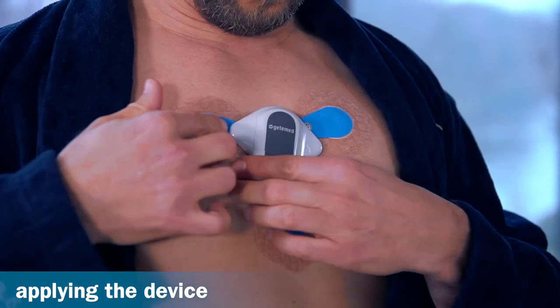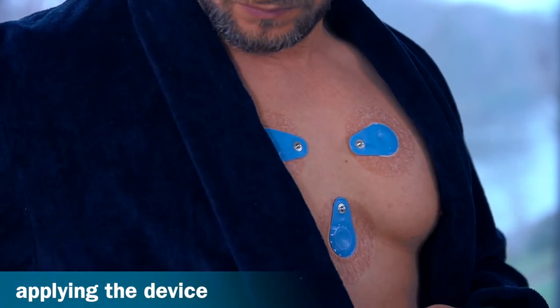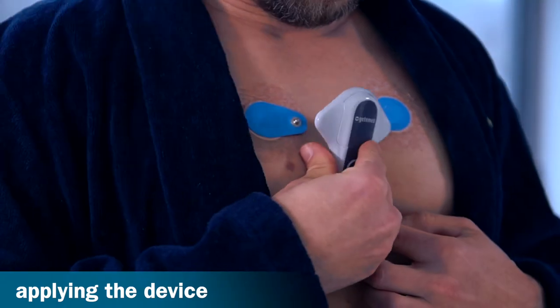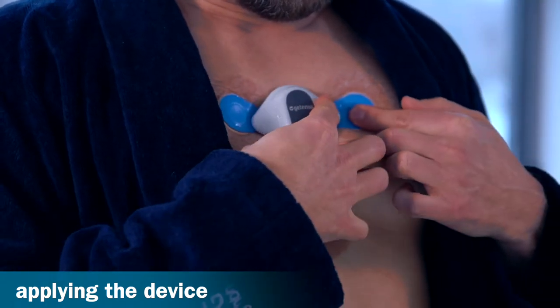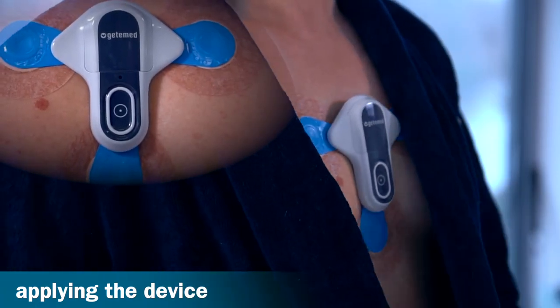Please remove the recorder before taking a shower and place it where it won't get wet. The electrodes can remain on the skin while showering. After showering, the recorder can simply be reattached to the electrodes. It automatically starts recording again.